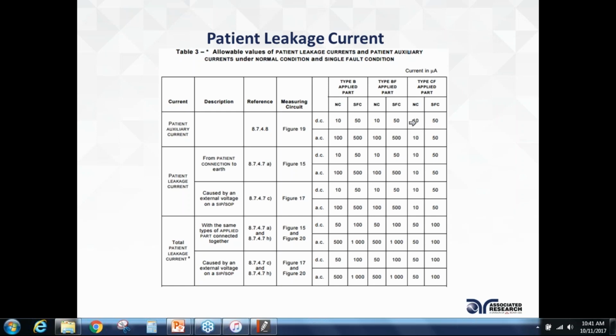That's why the leakage current now is in the 10 microamps range, because this is going to make direct contact with the cardiovascular system of your body, direct contact with the electrical signals in your body, and muscles and blood vessels and tissues. They conduct electricity pretty well, so at that point, your leakage current has to be in the 50 microamp range.